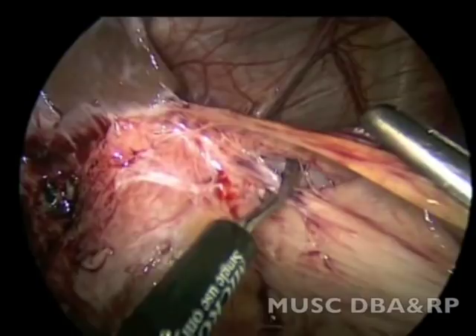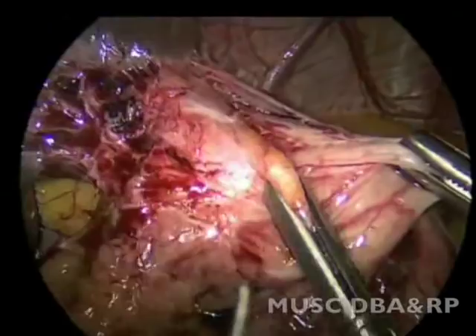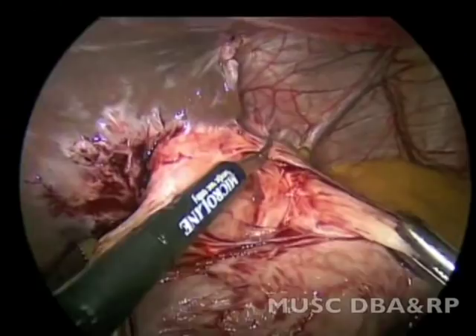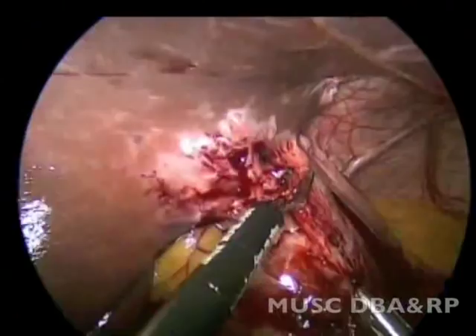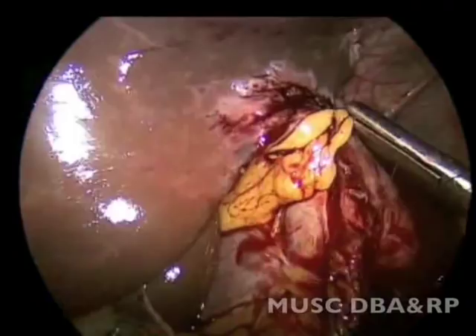The adhesions to the left lobe of the liver were carefully taken down with sharp dissection, with minimal use of electrocautery. The anterior portion of the wrap appeared to be adherent to the left lobe of the liver.